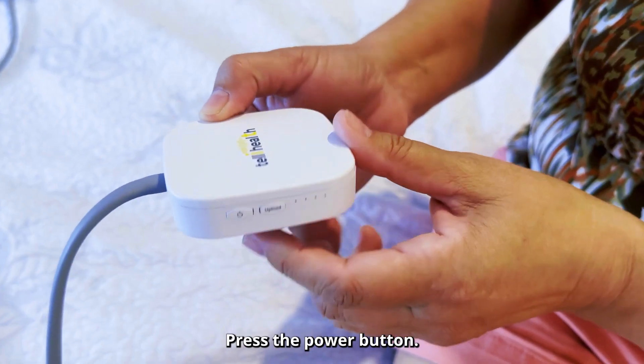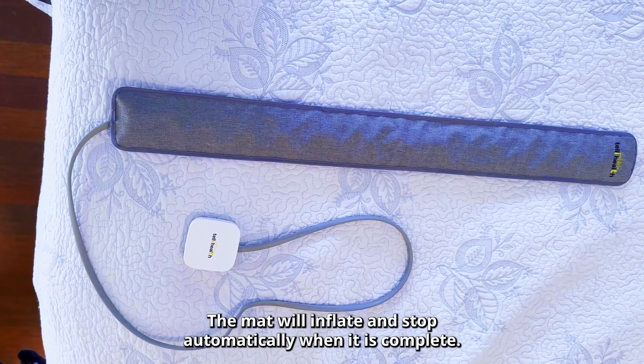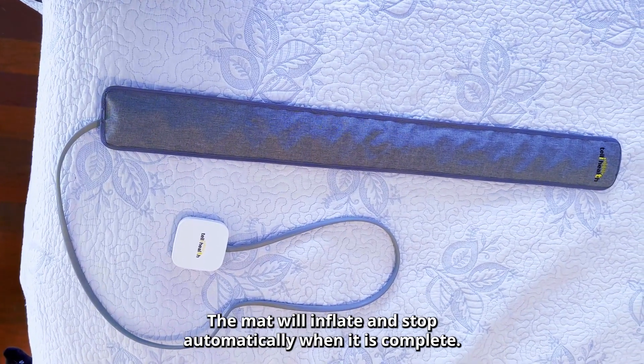Press the power button. The cuff will inflate and stop automatically when it is complete.